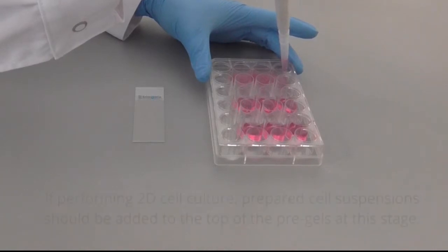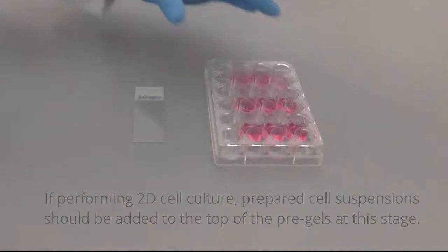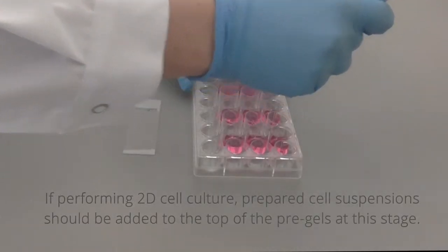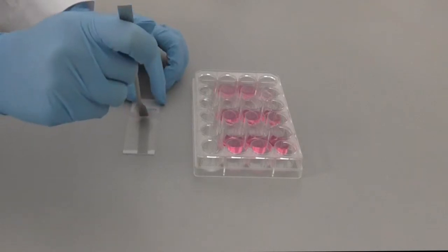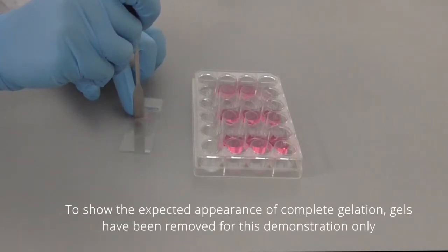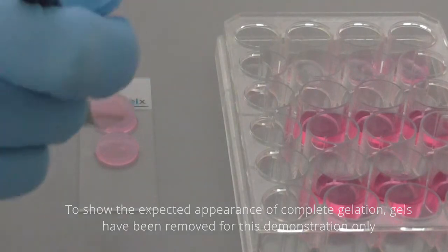After the appropriate incubation period, gently remove the cell media from the top of the gel and replace with the prepared cell suspension for 2D culture or fresh cell media for 3D culture. To show the expected appearance of complete gelation, gels have been removed for this demonstration only.